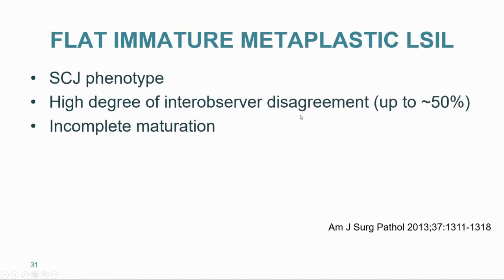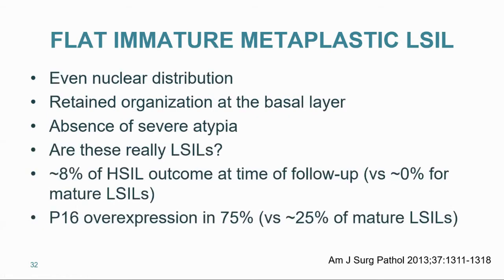Low-grade lesions that are flat and also display an immature metaplastic phenotype are difficult lesions, and let me say are quite controversial because they're difficult to diagnose. When you see something that is not maturing completely or is not resembling the maturation pattern of the normal ectocervix, you think of a high-grade lesion, right?